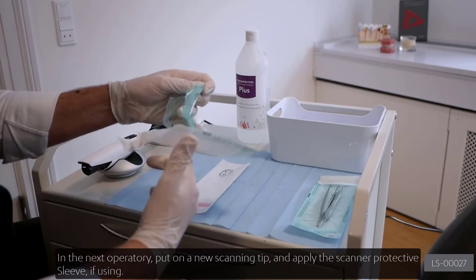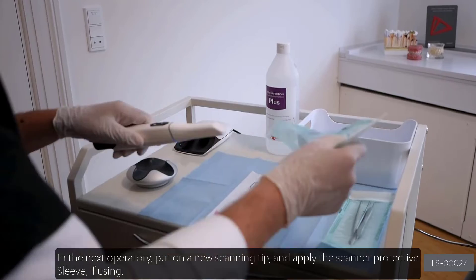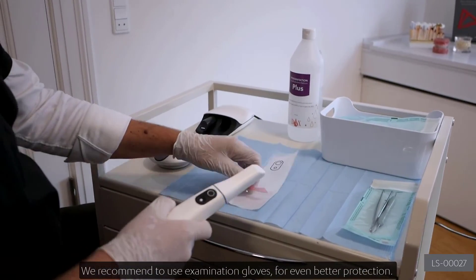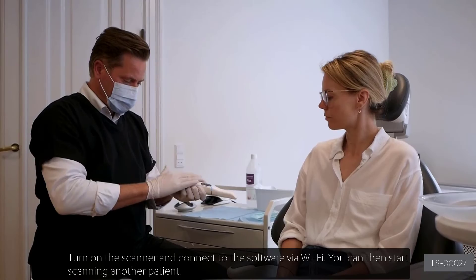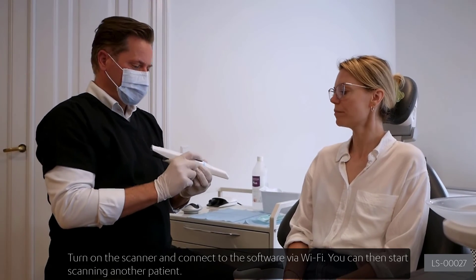In the next operatory, put on a new scanning tip and apply the scanner protective sleeve if using. We recommend using examination gloves for even better protection. Turn on the scanner and connect to the software via Wi-Fi. You can then start scanning another patient.